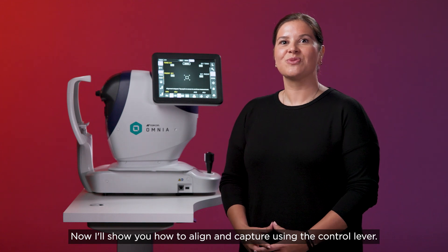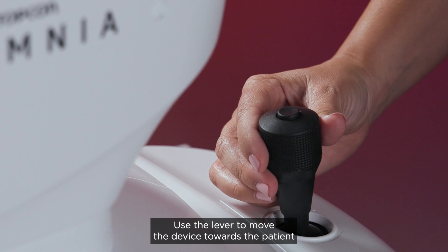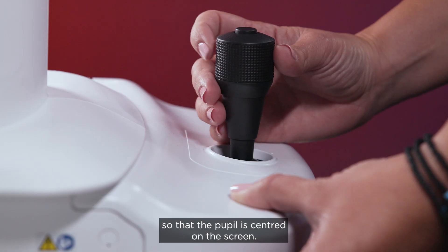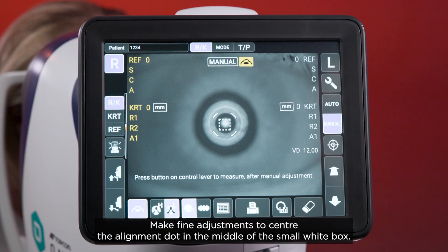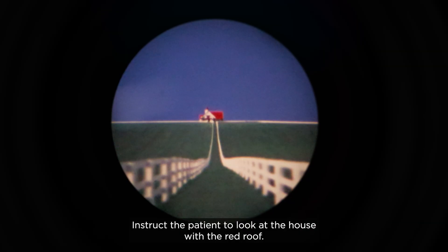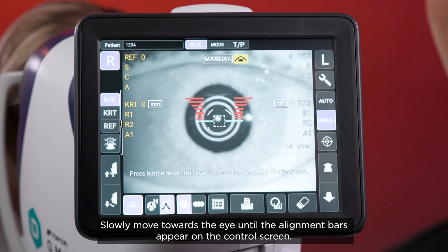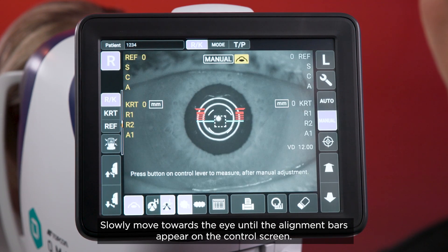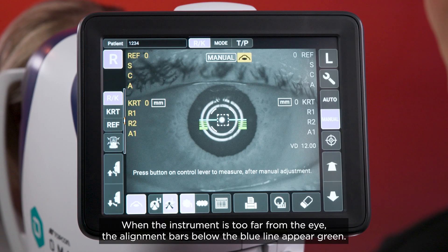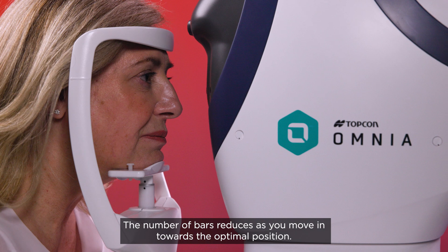Now I'll show you how to align and capture using the control lever. Use the lever to move the device towards the patient so that the pupil is centred on the screen. Make fine adjustments to centre the alignment dot in the middle of the small white box. Instruct the patient to look at the house with the red roof. Slowly move towards the eye until the alignment bars appear on the control screen. When the instrument is too far from the eye, the alignment bars below the blue line appear green, and the number of bars reduces as you move in towards the optimal position.